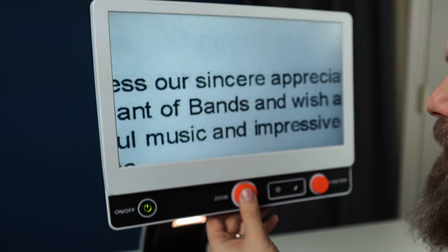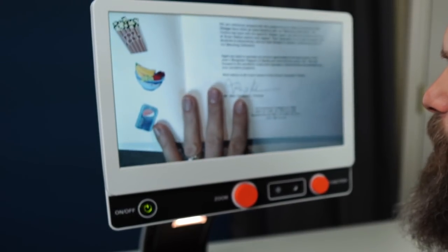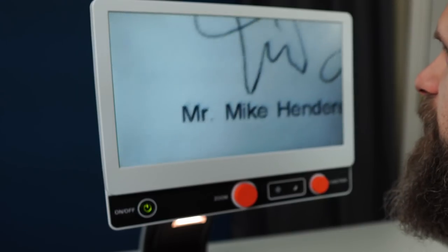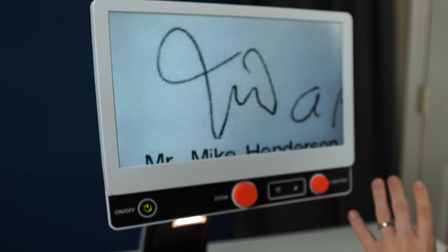If I click the magnification button, it's a finder, so it'll zoom out and I can readjust my paper for a different area to zoom in on. Say we want to look at that signature down there — when I click it again, it zooms in on it.